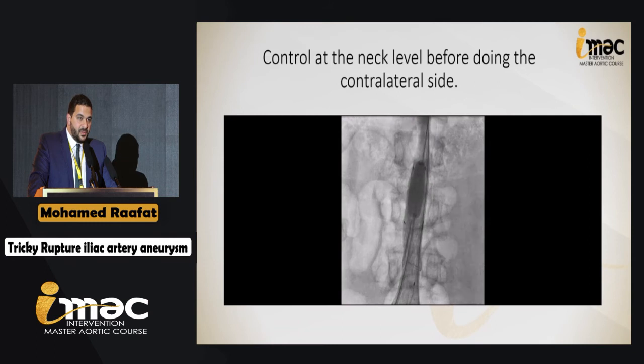After that was done, the second balloon, aortic balloon, was inserted from the right side and placed at the level of the neck of the aortic graft, inflated. Then the other balloon, which is more proximal, will be deflated, and then we'll start using the left femoral access to try and cannulate the device and deploy the contralateral limb. The idea is to, as I said, always try and maintain no leakage.